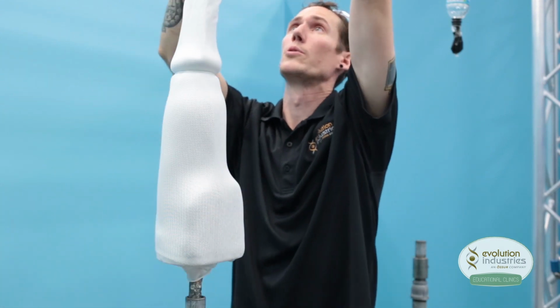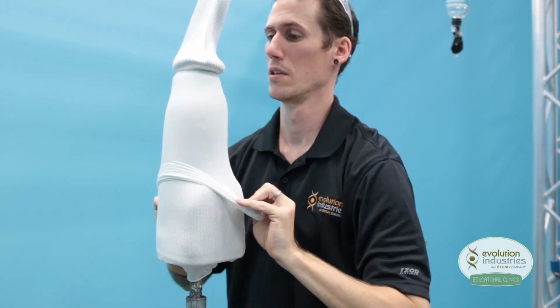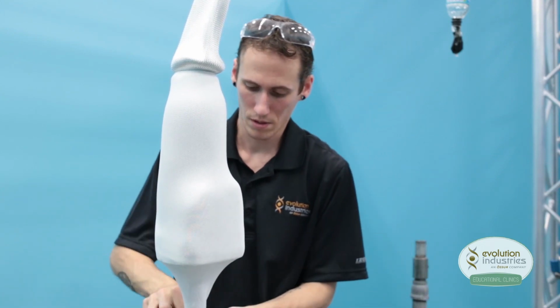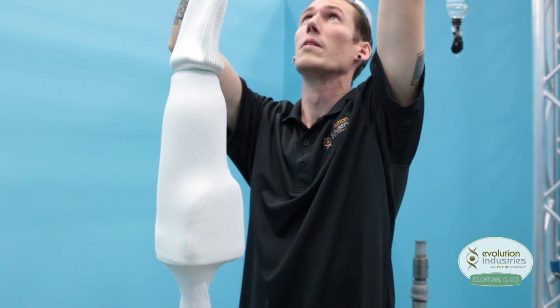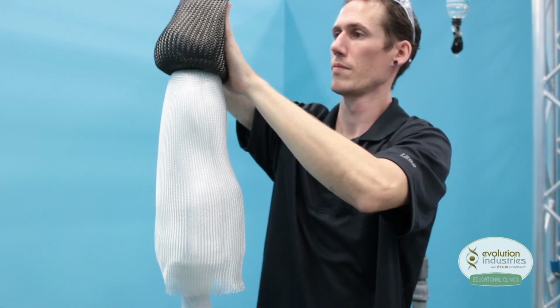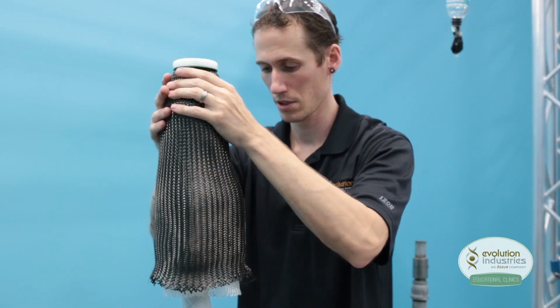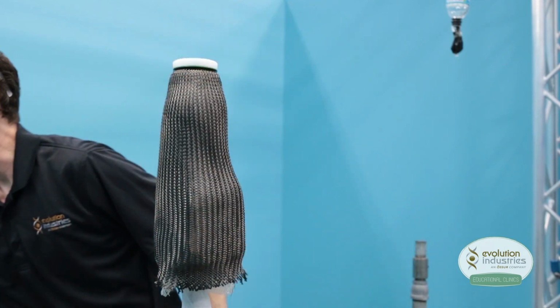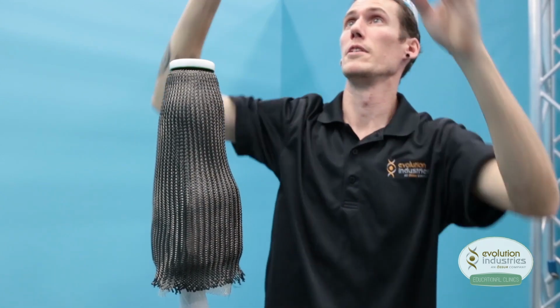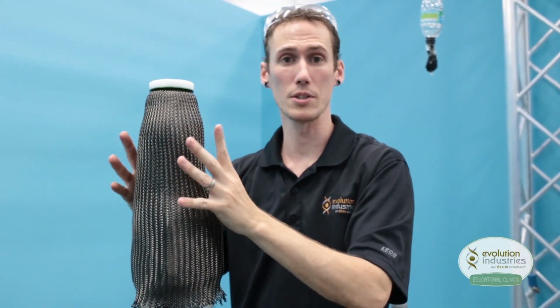And then one by one, we reflect each layer down. And carbon winds up on the outside, which will give us a nice carbon finish. And our PVA bag should be ready. So for the carbon finish, before I pull it over, I will invert the PVA bag to give a nice glossy shine to it.